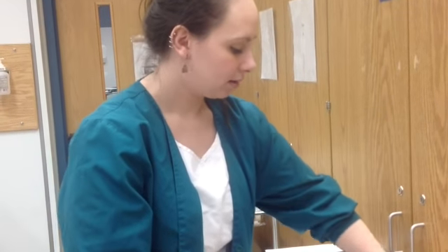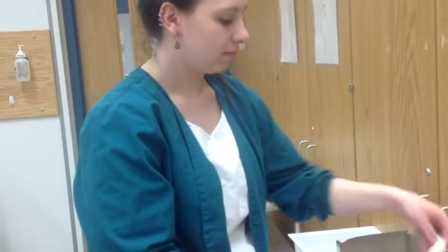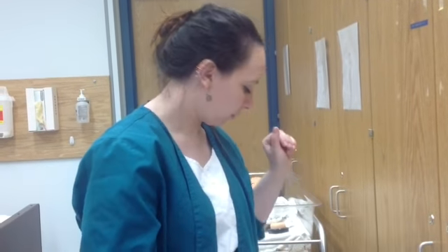I'm going to have an alcohol swab, a cotton square to put pressure after the injection, and then you can put a piece of tape if someone wants to keep it there. Otherwise, you can just use a Band-Aid. And we're going to go check on the patient.